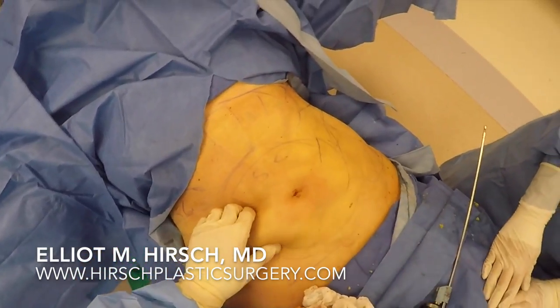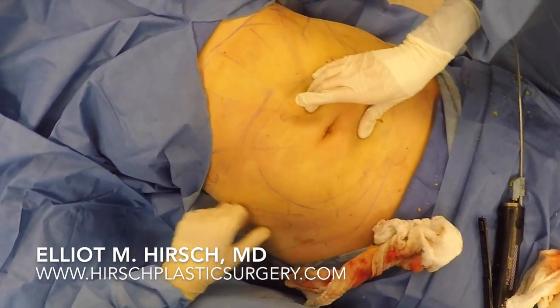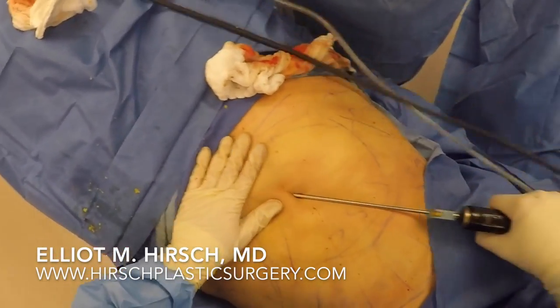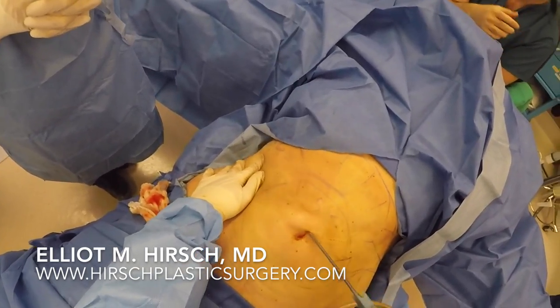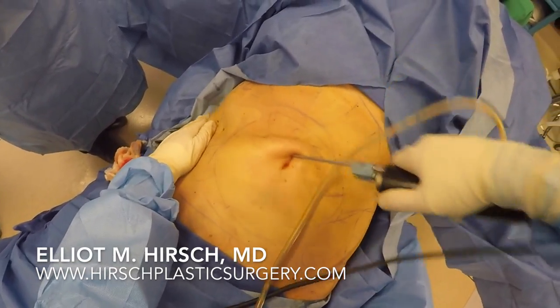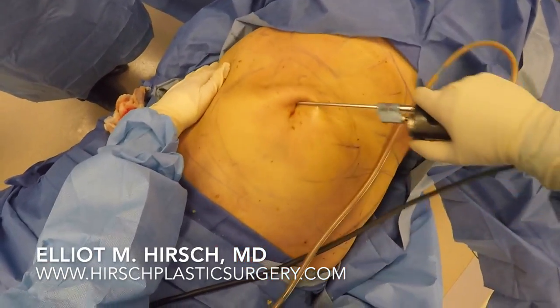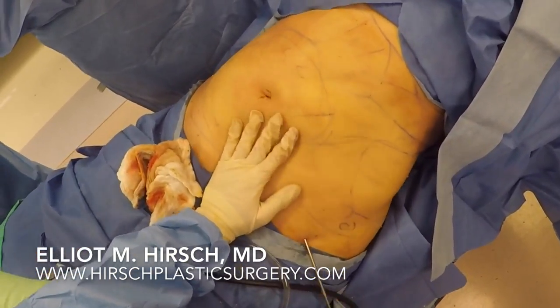Once this step is complete, the fat is much softer and is ready to be removed with liposuction. Next, the Mercedes tip cannula is placed onto the power-assisted liposuction device and now the fat is actually removed. You can see the yellow fat flowing through the tube that is connected to the cannula. Once again, the left hand guides the dissection and ensures proper placement of the cannula. It is extremely important to be precise in both cannula placement and the amount of fat removed so that contour deformities are not created.